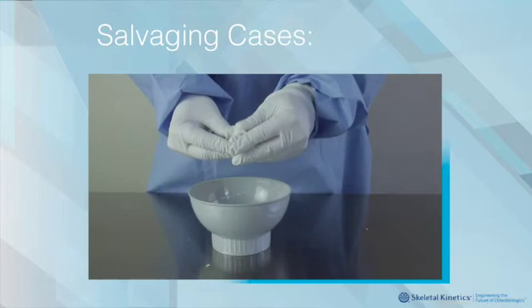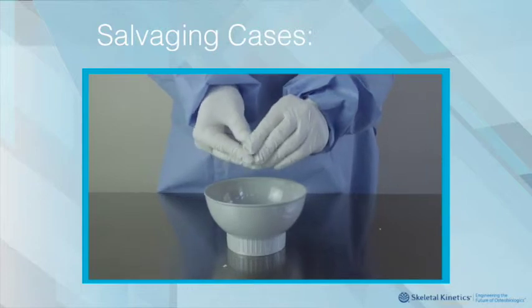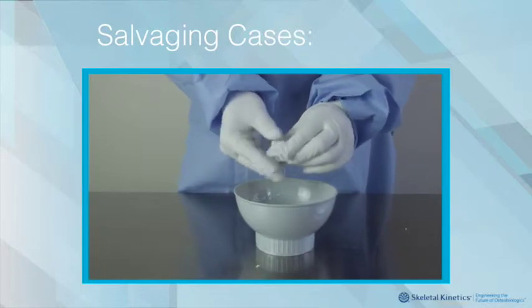Now we'll go over some salvaging techniques for scaffold cases. As mentioned, it is time and temperature sensitive. Therefore, some of these tricks of the trade can help aid you in your cases to get out of trouble.